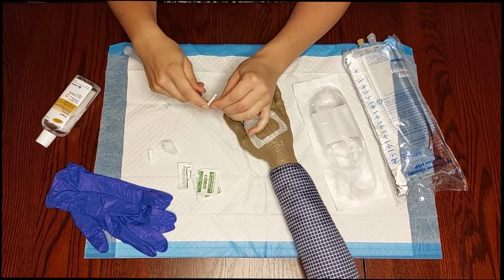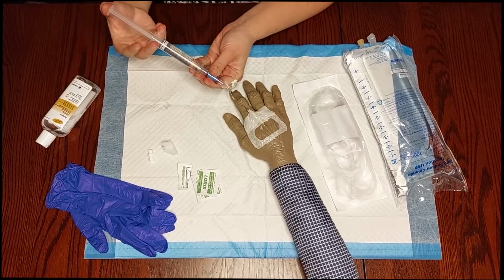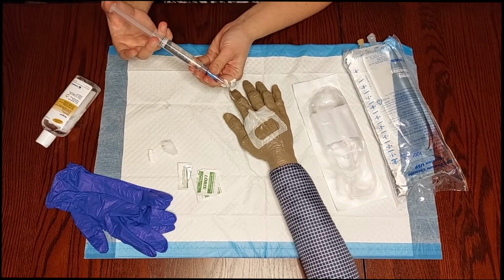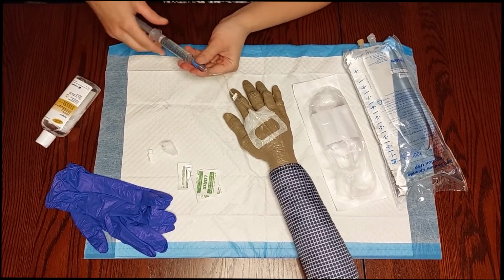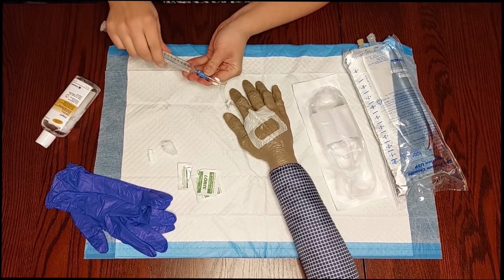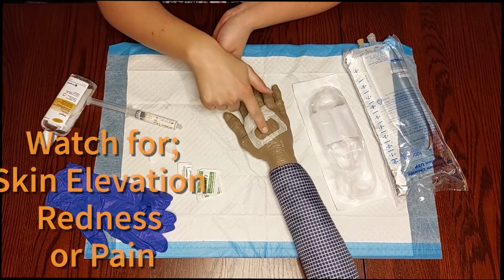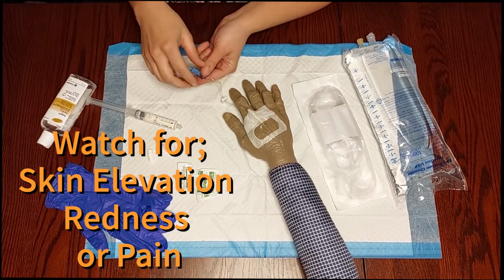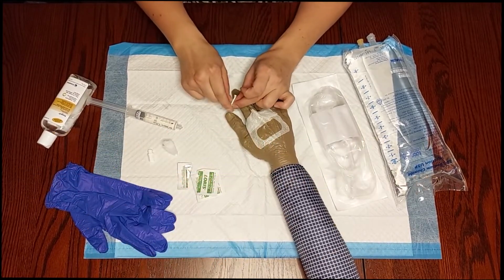Then we're going to unlock our IV so it can flow, and you would slowly pulse this in. Now, I'm not going to put anything into my fake arm here, but you would push about halfway in, very slowly, and you're watching this area, making sure it doesn't bubble up or start to cause a lot of pain. So now we know that our IV is good.